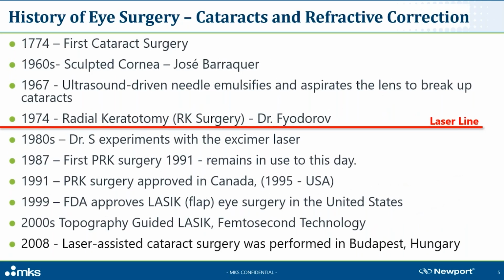Speaking of eyes, I wanted to show how the laser revolutionized eye surgery. The first cataract on record was removed in the late 1700s in France. A curved needle is inserted into the eye, hooks the opaque material, and is pulled out. Then the eye is left to heal. It sounds painful.